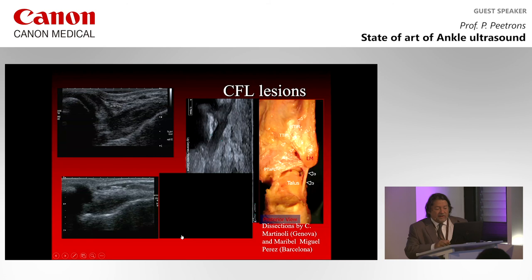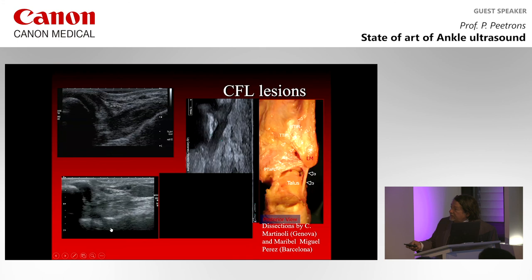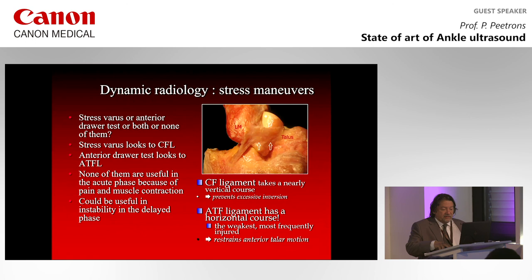In the opposite, an abnormal ligament will not show tension when you do the hyperextension. So the dorsal flexion of the foot, you can see that the ligament will not move again and will not push the peroneal tendons towards the probe. The peroneal tendons stay there. This is a very good image of an abnormal CFL lesion.